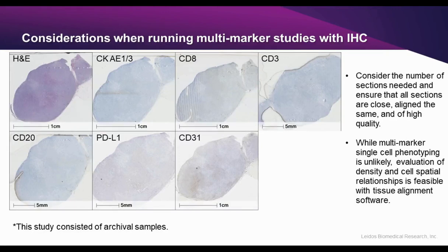Here, we provide some archival images that we are hopeful to run spatial analysis across the markers. But once we took a quick look, we realized that this set would not be suitable for multi-marker spatial analysis studies. A quick glance at the image series notes multiple issues, from incomplete sections, section vibration artifact, and inconsistent background staining. Alone, these issues present their own challenges and are further compounded when trying to get associations between markers.